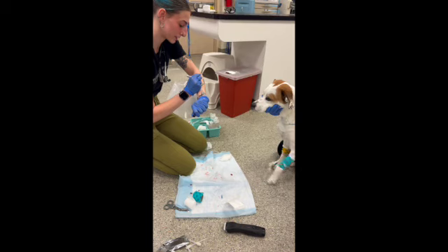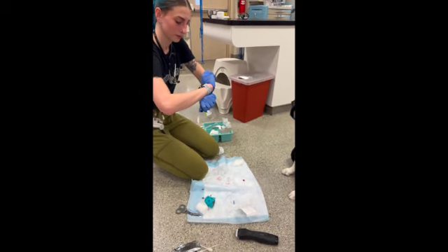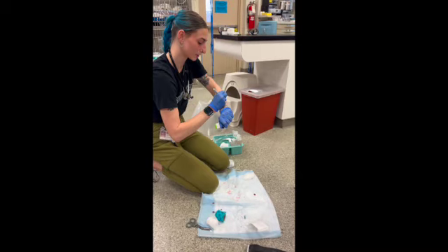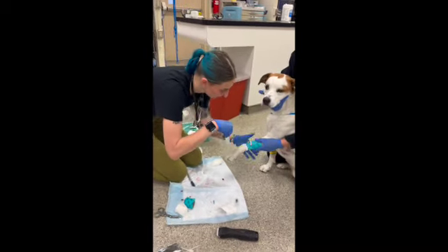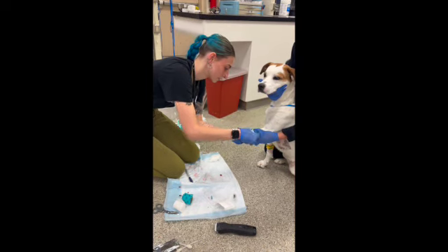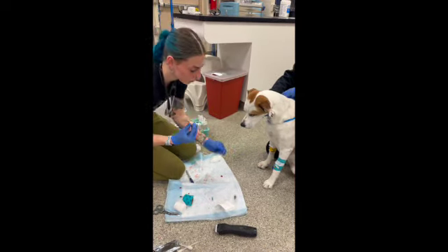So we like to notate what size catheter it was, the date and the time that it was placed, and then just initials because I was the one who originally placed it. Just an orange swab cap on the end.